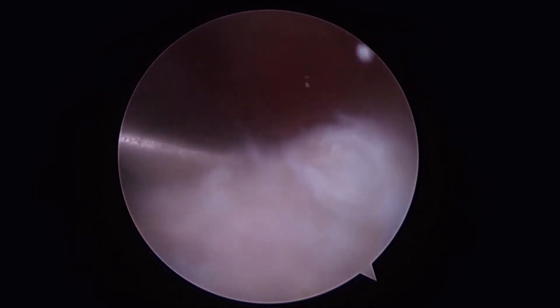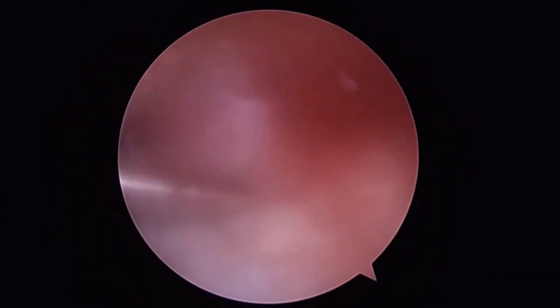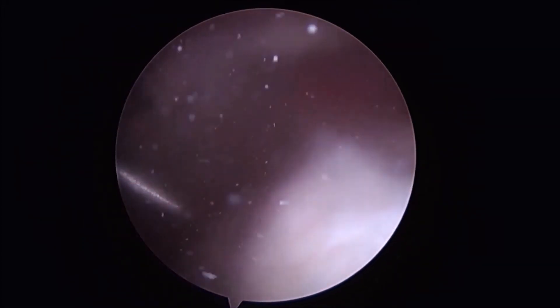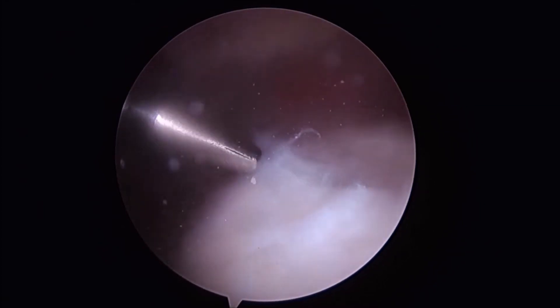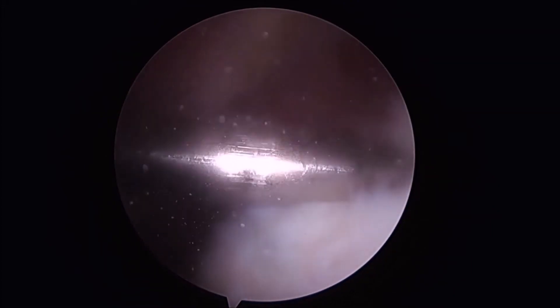At this point we can evaluate our rotator cuff to examine our defect. The rotator cuff itself is then palpated to ensure that there is no full thickness defect. We then locate the lateral aspect of the humeral head to identify our starting point for replacement of our guide pin.